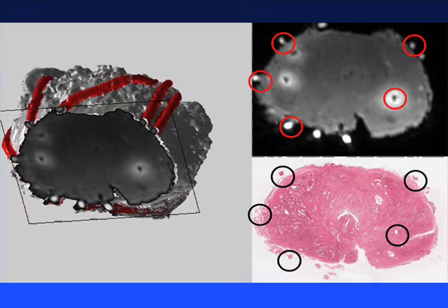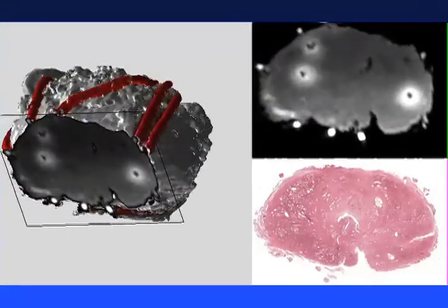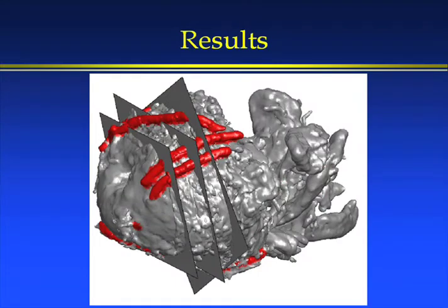The way that we identify these histology planes is that the fiducials that we've added are visible on the histology and also on the MRI. So if we look at a slice of MRI, and you can see this cutaway in our surface model here, you can see the configuration of these matches. And if I play this video, you'll see that this configuration changes as we look at different slices of the MRI. So by matching the configuration on histology to that on a particular MRI slice, we can identify which slice in that MRI contains the same tissue as the histology image. And once we've done that with all the slices, we have a picture like this, where we have histology reconstructed into 3D and simultaneously co-registered with a 3D image that we can use for registration.